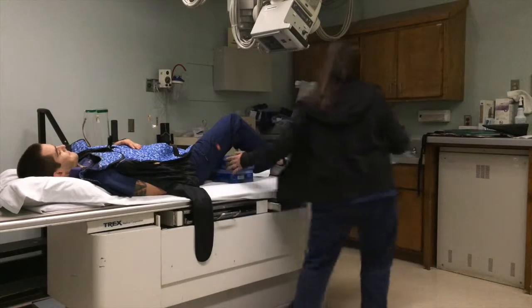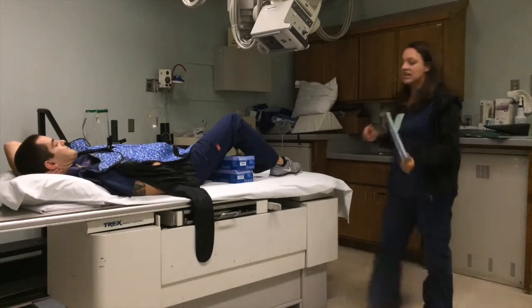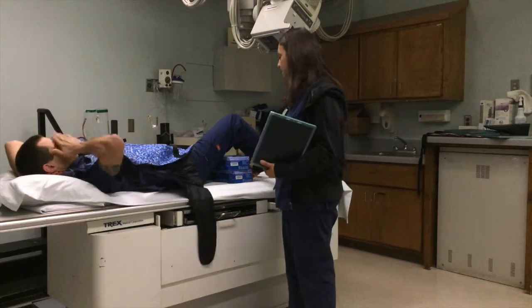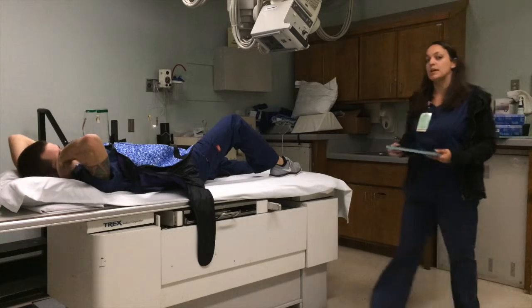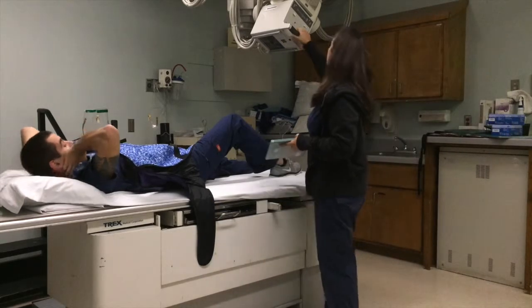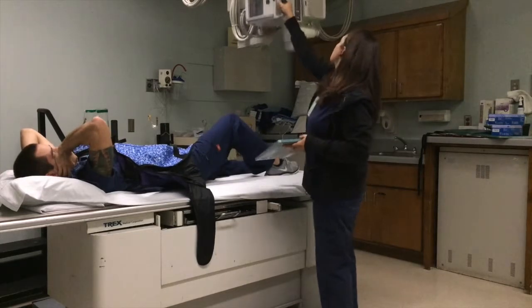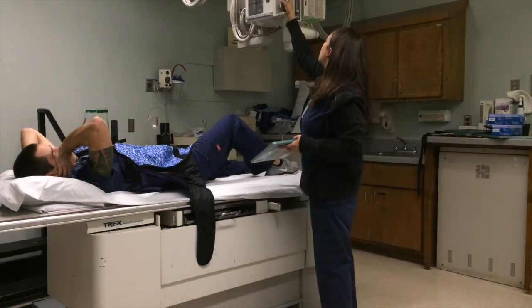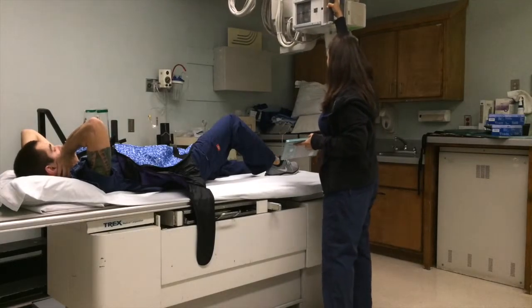So now the next image we take is going to be a tangential patella. With this, I'm going to actually incorporate my patient into helping me. I'm going to get this over and down.